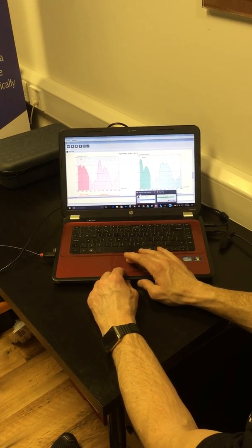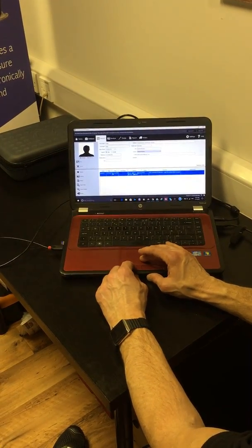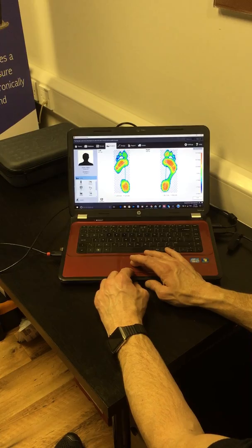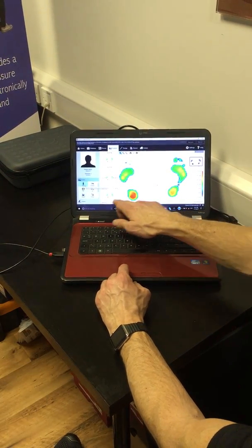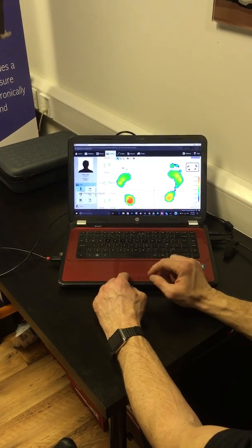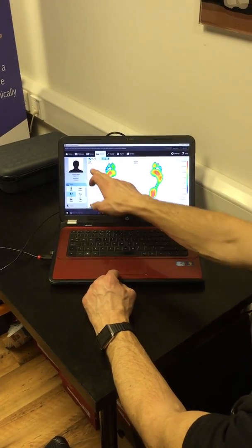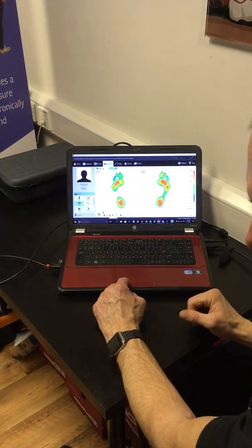And then when we look at your foot scan results, we know that we've got quite a lot of stuff that we need to work on here, don't we? Just in the static, you're loading that left foot. That tells us we're loading the left foot when we're standing. And we've just watched you run, and of course you load your left foot. We can then go to your 2D version of it, and we can see you spending longer on that, which is what this is telling us. So you're getting more propulsion speed from that.